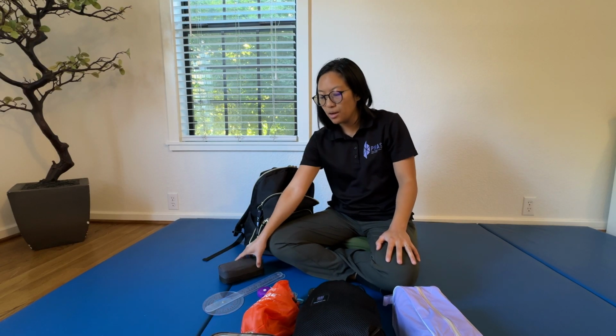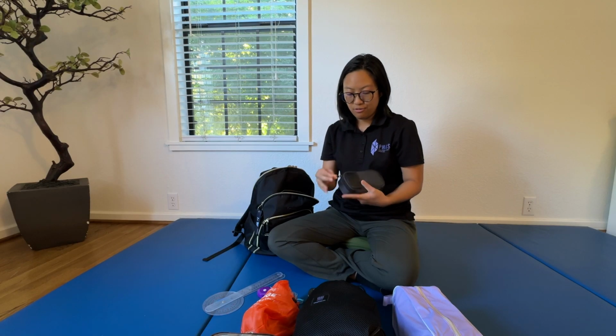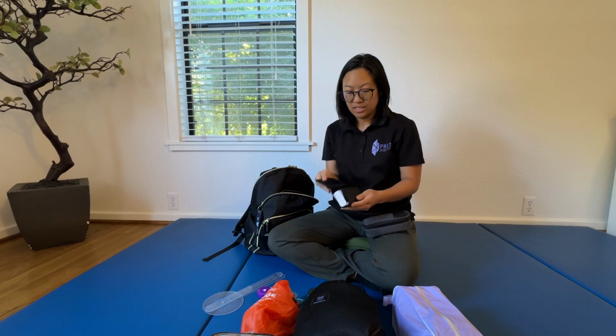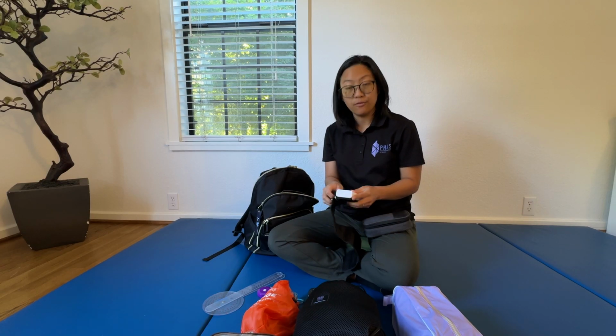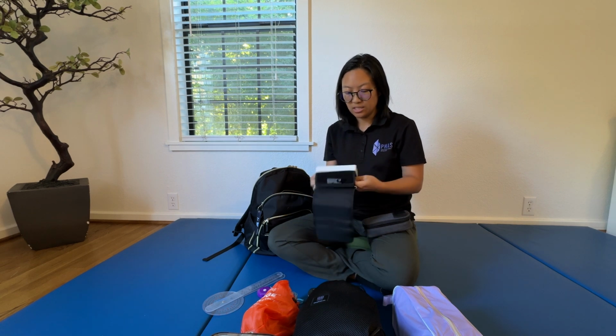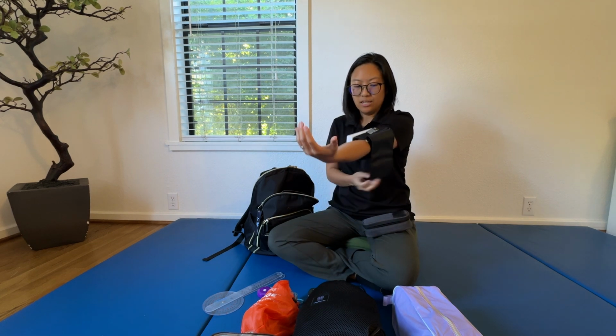So with this cardio blood pressure cuff, I like it because it's Bluetooth. I can connect it to my phone. And so off of my phone, that's how I'm able to actually test blood pressure for people. It's nice. I can just slide it right on.